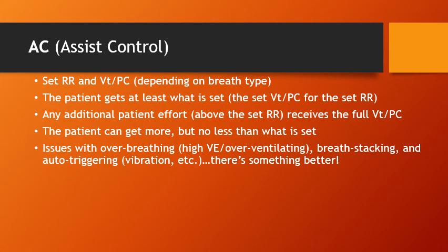It can also cause breath stacking. And when I talk about breath stacking, we're talking about the ventilator trying to start another breath before the previous breath has been fully exhaled. So again, if the patient is very tachypneic, they don't have time to exhale the last breath before the ventilator tries to shove in another 400 milliliter tidal volume.